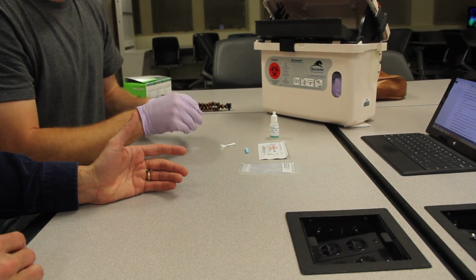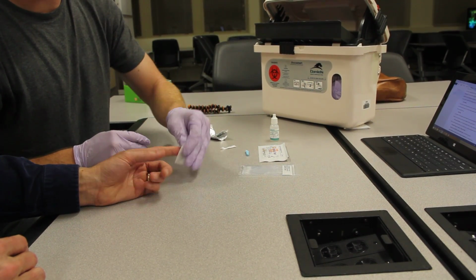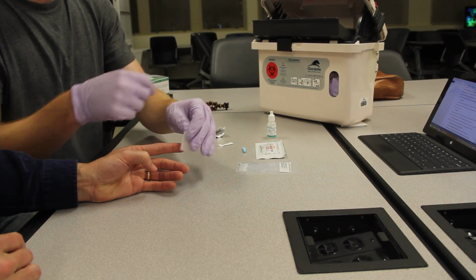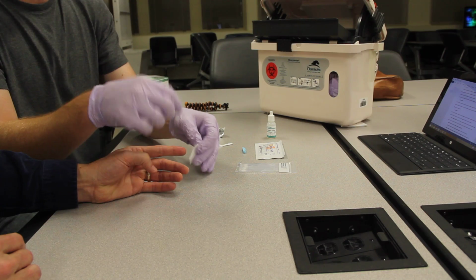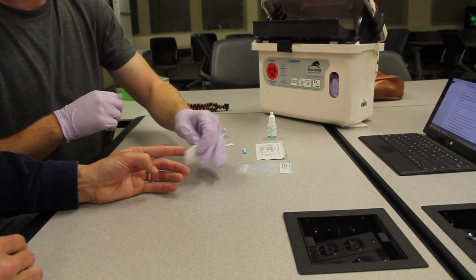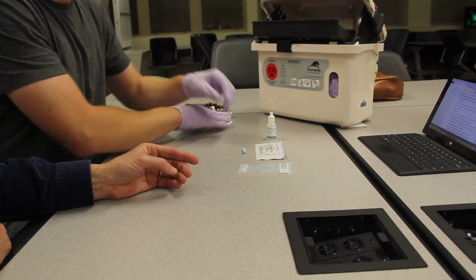So I'll get out this alcohol swab here and be really thorough, just making sure I can clean off anything that might get in through the lancet into his skin once I prick him. We don't want to have an incidental infection from that. Set this off to the side.